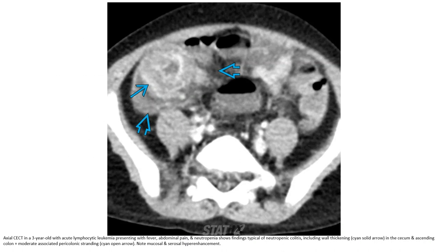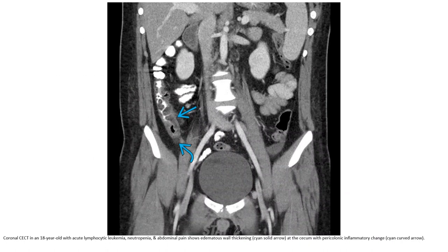Note mucosal and serosal hyperenhancement. Contrast-enhanced CT in an 18-year-old with acute lymphocytic leukemia, neutropenia, and abdominal pain, showing edematous wall thickening of the cecum with pericolonic inflammatory changes.